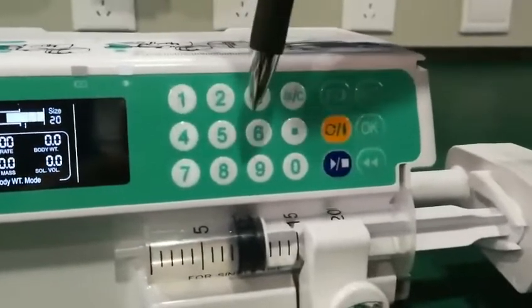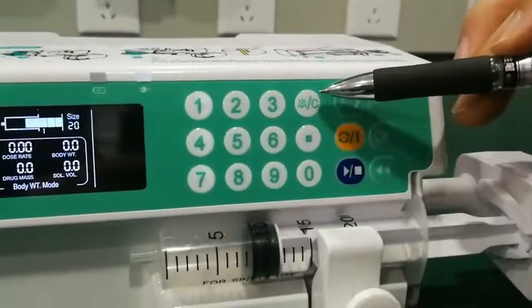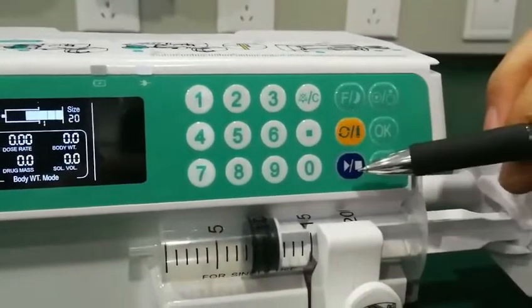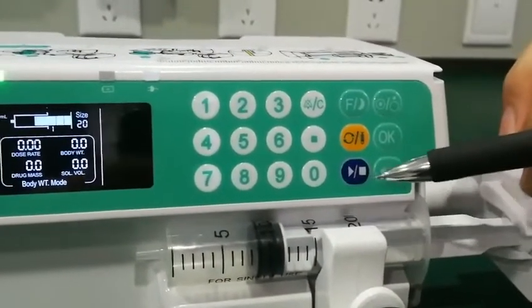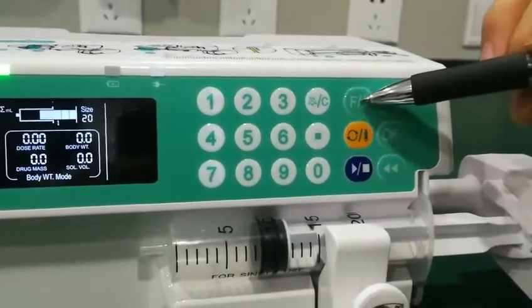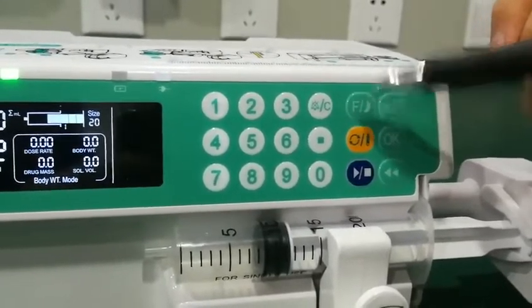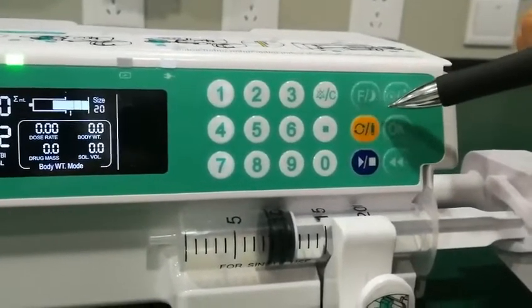Here is the keypad to set the machine parameters. Here is alarm and clear, here is start and stop, here is bolus and confirm. Here is night mode and occlusion level selection. Now I will introduce you to some functions.